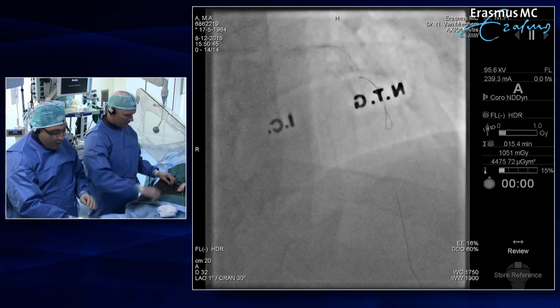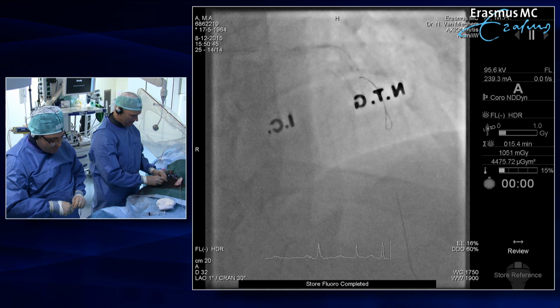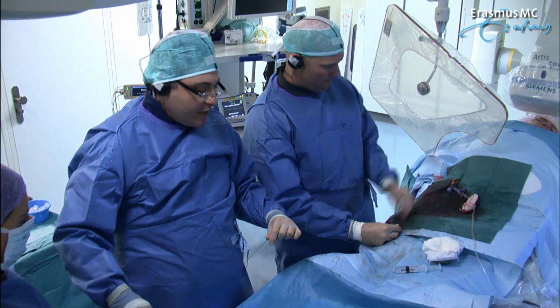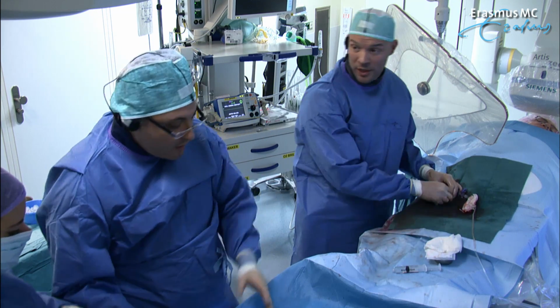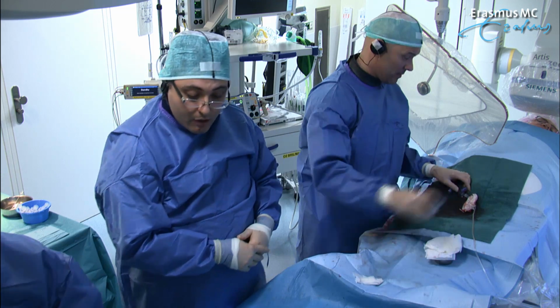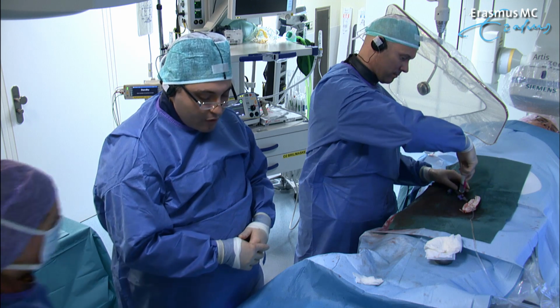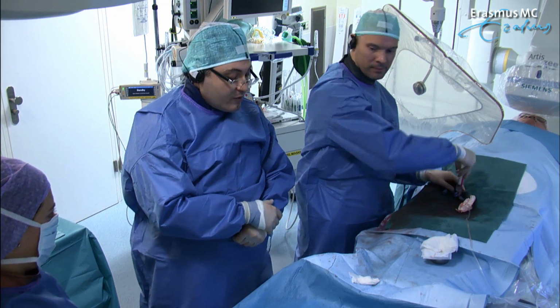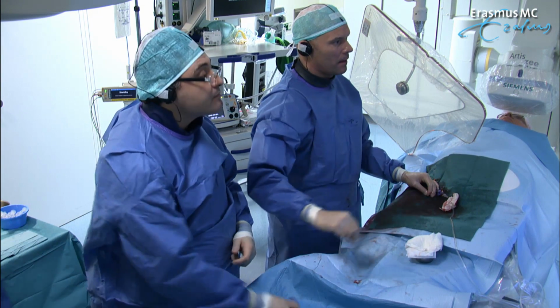I think that the use of a microcatheter is making our life easier in this case, because recrossing a left main stenting to re-perform an FFR after a two stent technique is not without risk. You could go behind the struts and have problems going down with the FFR. In this case it was very easy, and fast, I must say.